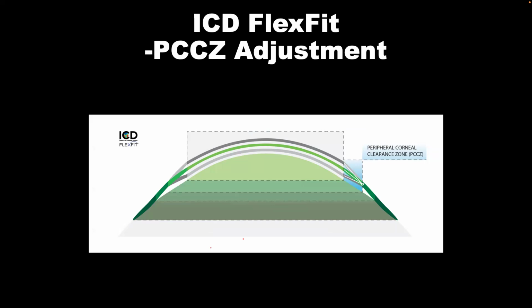The reason is to try not to make that many changes, because sometimes making that many changes on a lens design may alter the final result. So if you're changing over 8 steps on zone 2, I would strongly suggest as well to change the lens. Just take it out, put it in.